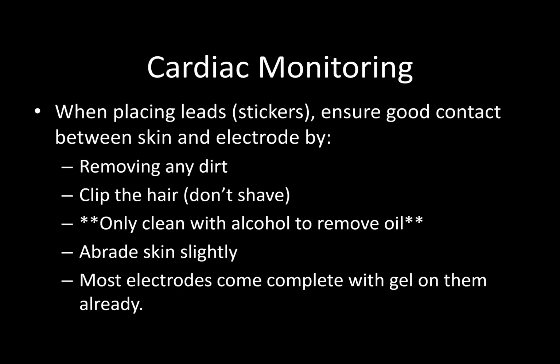All right, I am taking the time right now to say this because it is the absolute foundation of being able to read ECGs and EKGs. You have to put the stickers, the leads, on correctly and well in order to get a good signal. Otherwise, it's like trying to watch a high resolution video on your mobile device when you've got a bad Wi-Fi connection. You're going to be skipping all over the place. It's going to be blurry. It's just not going to work right.